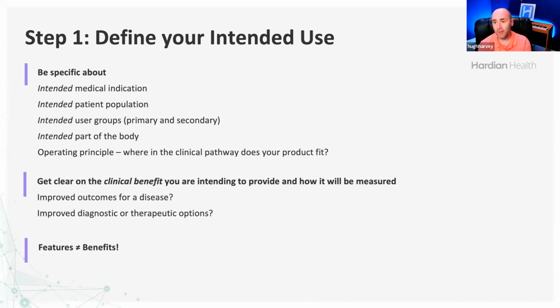And I think it's very useful. The MHRA themselves have recently released a really good blog on their website defining intended use, specifically around AI-driven software medical devices, which outlines, again, all of these key points very clearly with more fleshed out examples. So I do recommend that, and we'll share that in the materials as well alongside this webinar.